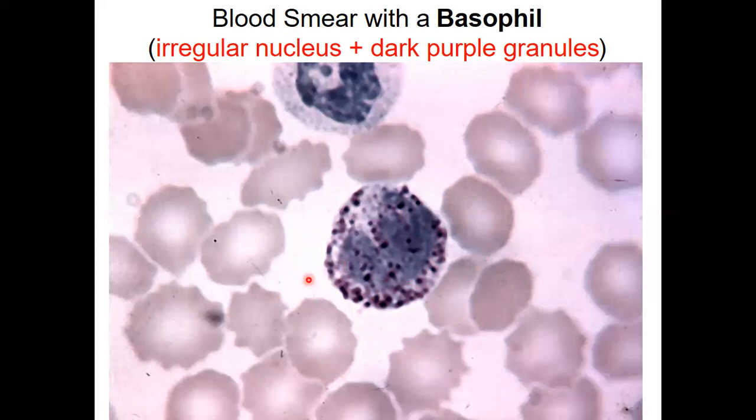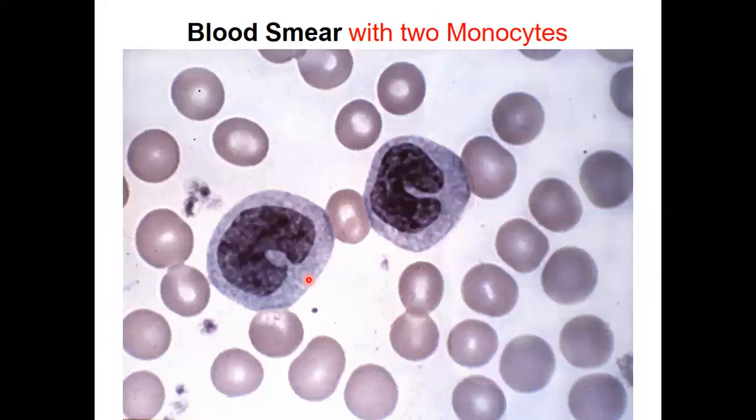Next type of cell we're looking at is a monocyte. So we are now seeing that a monocyte has a kidney-shaped nucleus. So the nucleus is distinct. It's not occluded by any granules. So monocyte has no granules in cytoplasm. So the nucleus becomes clear.